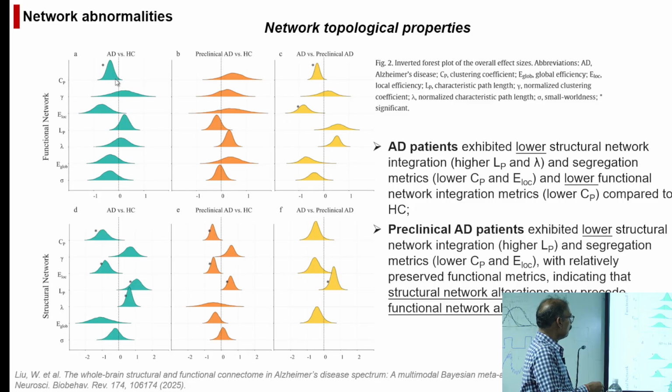And the hope is that as we try to get more information, we can also use additional tests which can perhaps find more specific measures. And while just gray matter measures may not be enough, perhaps using in conjunction with white matter, we can find significant differences, which can help us better make predictions about Alzheimer's subjects. I think that is all I have.